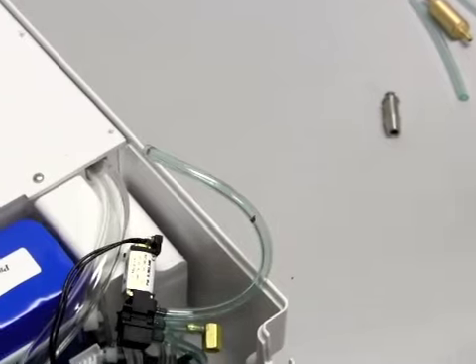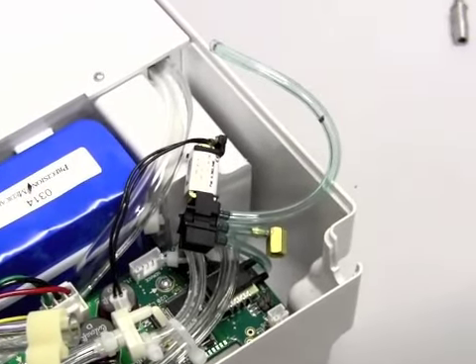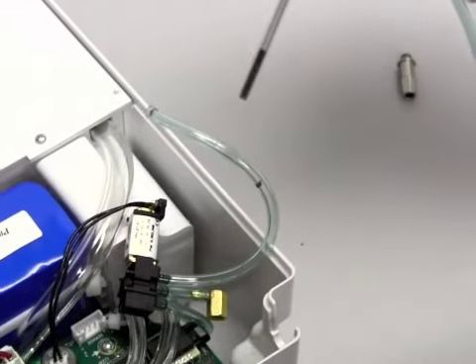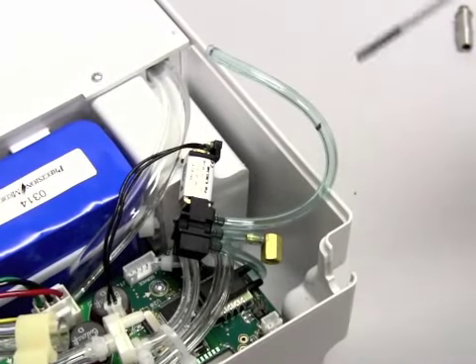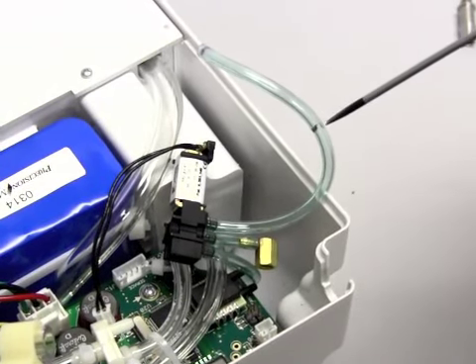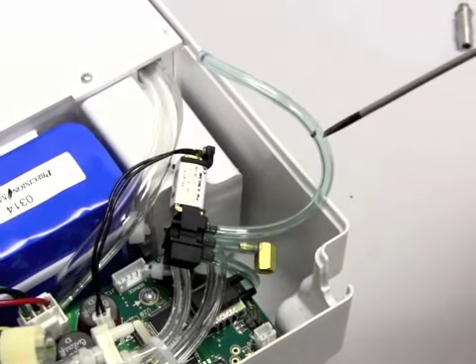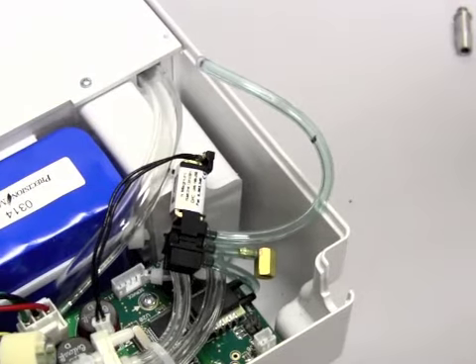This shows that I have removed the valve and disconnected it from the stainless steel barb that holds the cannula, and I've also disconnected the tubing from the pressure sensor. What you want to do now is take this tubing and cut it off at approximately 2.5 inches. So from the valve, that third port, that tubing should be cut at 2.5 inches.